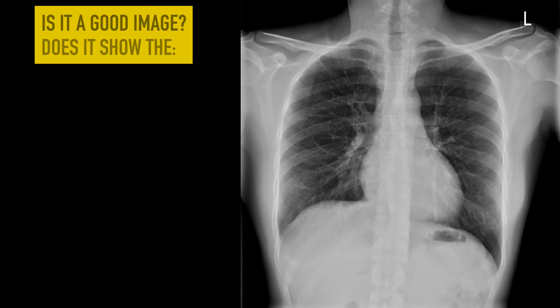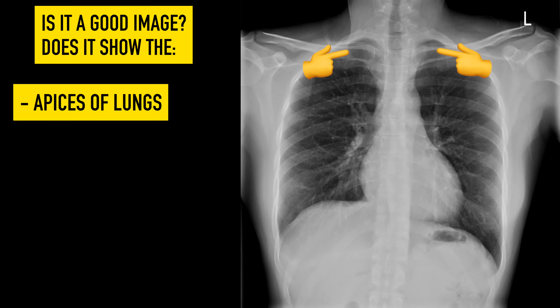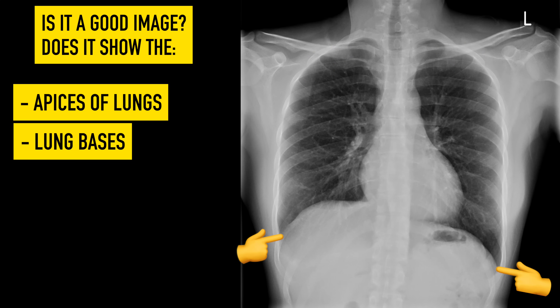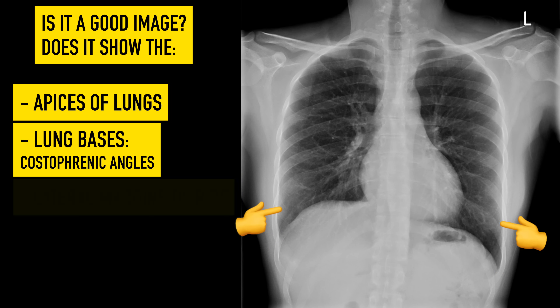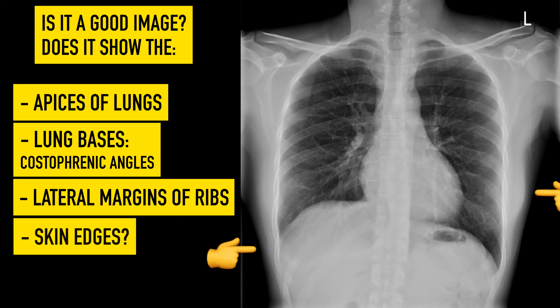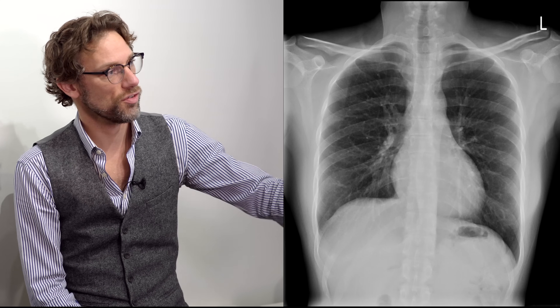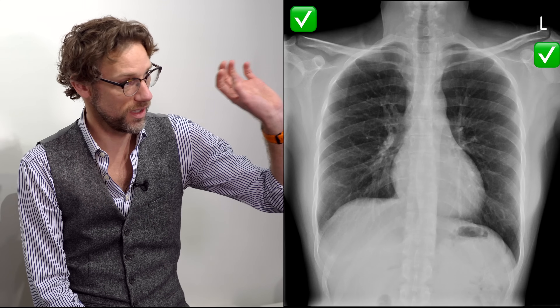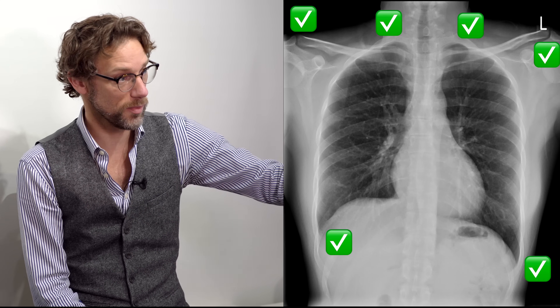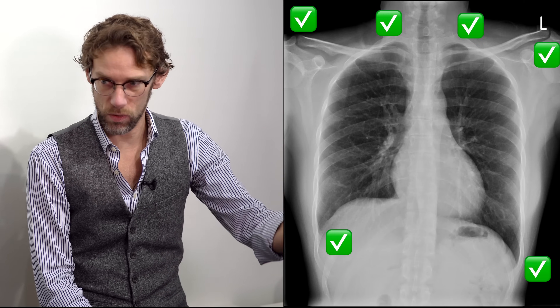Now, have we got everything on that we need to see? At the top of the image, we want to see the apices of the lungs. At the bottom, we want to see the bases of the lungs, which you can see with the costophrenic angles. At the sides, we want to see the lateral margins of the ribs. There's an argument for seeing the skin edges, but depending on patient size and equipment limits, you can end up giving far more X-rays than intended. On this X-ray, I can see the edge of the clavicles, the top of the lungs, and the costophrenic angles — so I can see all of the lungs.